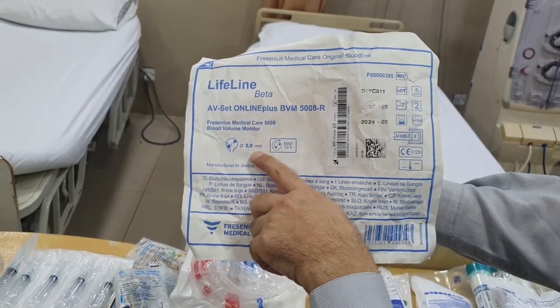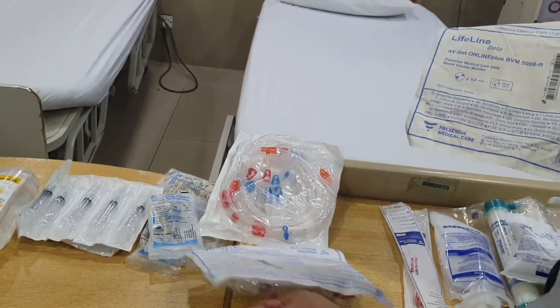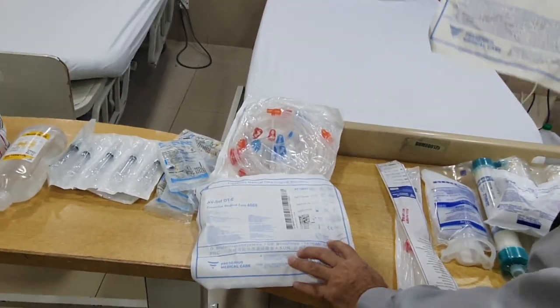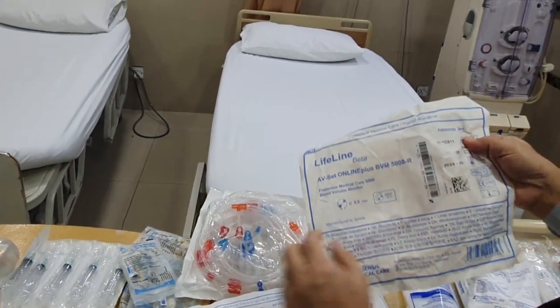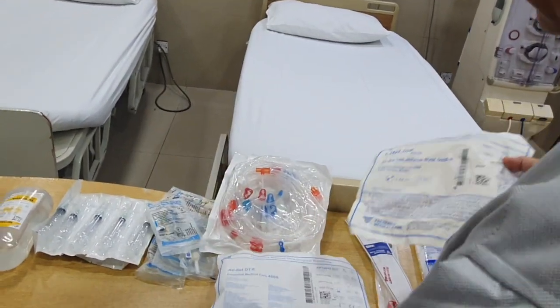So it's important that before you proceed, if you're using a universal one, you need to see what the size, what the diameter of these machines is. So this one is a 12 millimeter one. This one is an 8 millimeter one. So it really depends on what the clearance is as far as these machines are concerned.